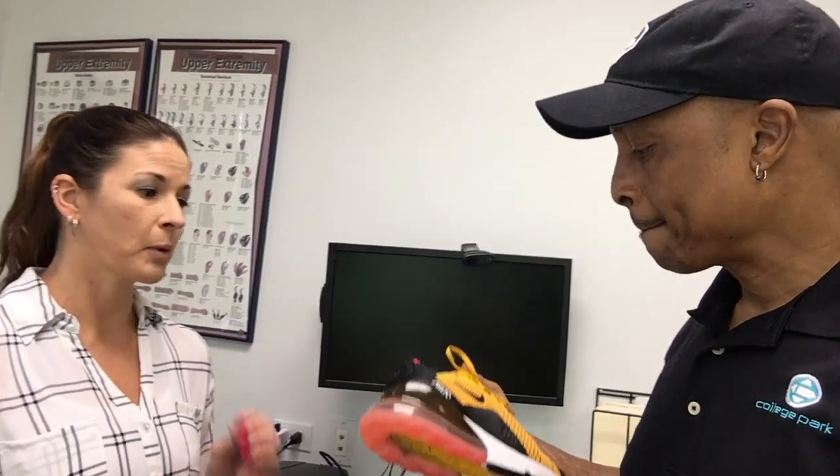I would tell you number one is to make an appointment just for that objective with your prosthetist. It's really important to go through a lot of the shoes you're potentially going to be wearing and hear how to adjust those properly, so that you know for the future. We know you're gonna get new shoes, we want you to be able to change your shoes and have the confidence and the knowledge to do so without developing wounds or discomfort.